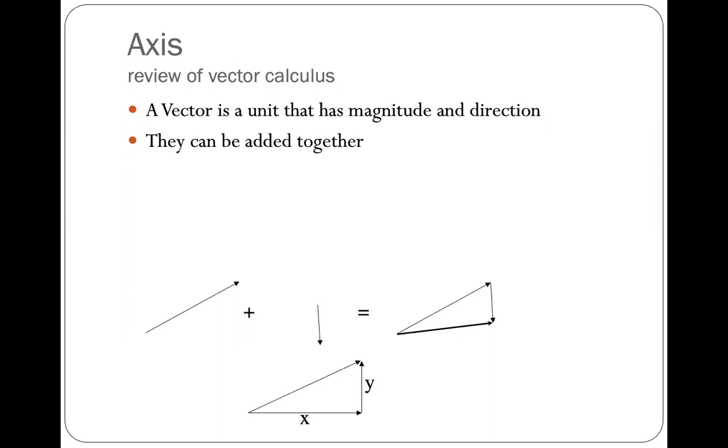And so the compilation that you see there is the darker bottom line. This darker bottom line down here is the average where the actual electrical activity is traveling, because that's the average of what these other two are creating. And so that's really what we're talking about when it comes to axis. We're looking at the average of the electrical activity in the heart.